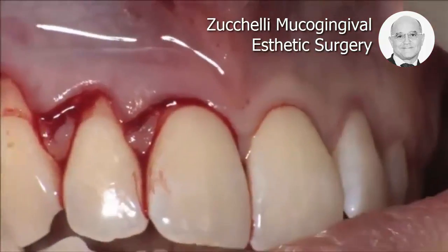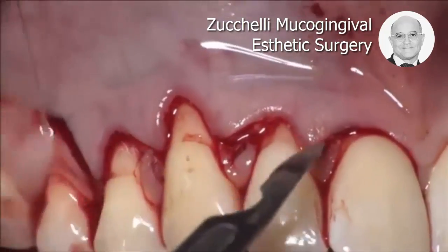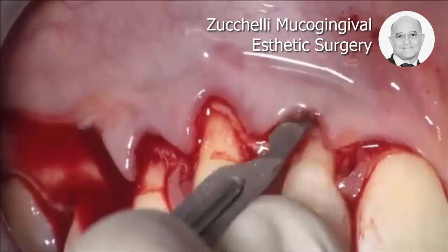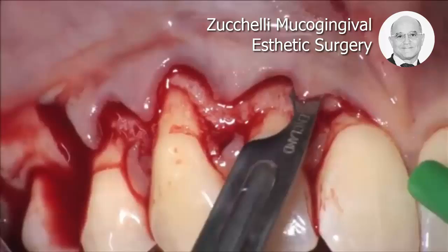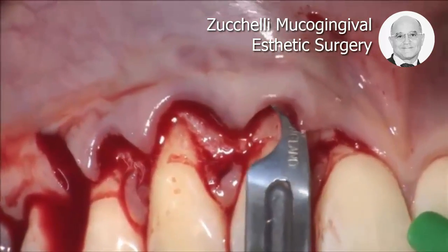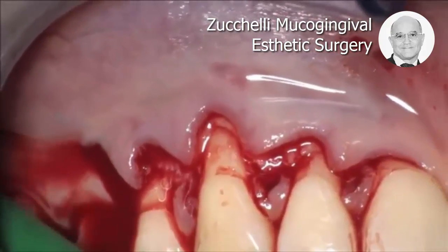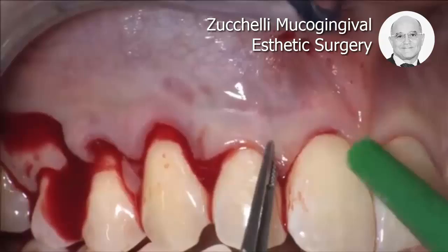Now, I have to make some deep and superficial incisions also at the level of the central incisor. This is the deep incision, and this is the superficial one, which uses the blade parallel to the soft tissue, so that this papilla will rotate and cover also the lateral.